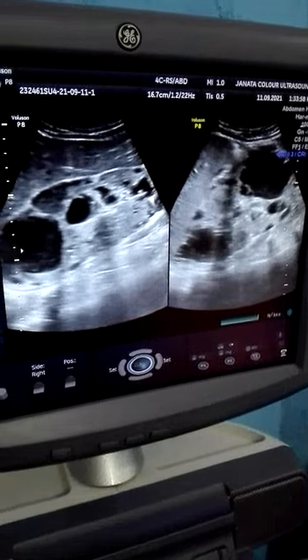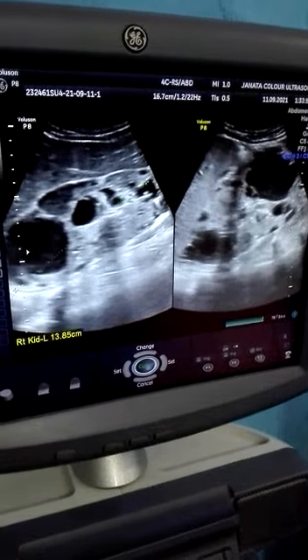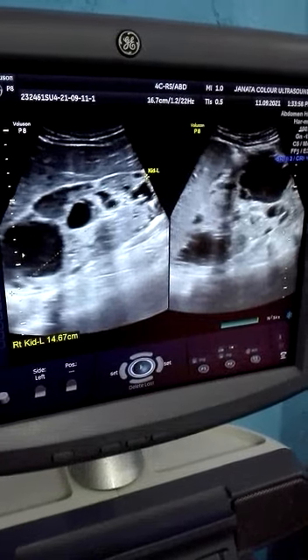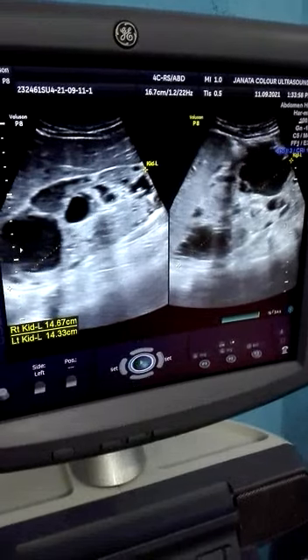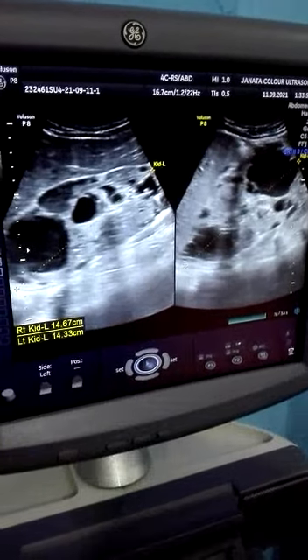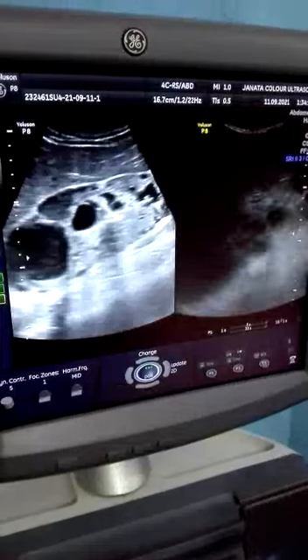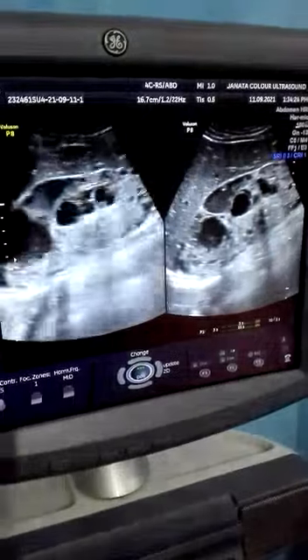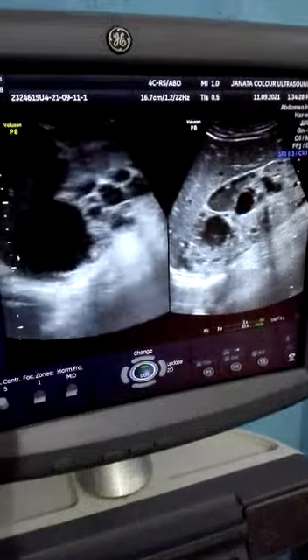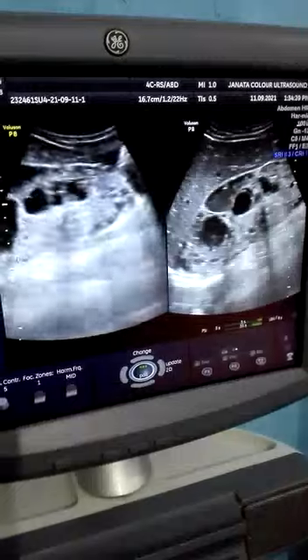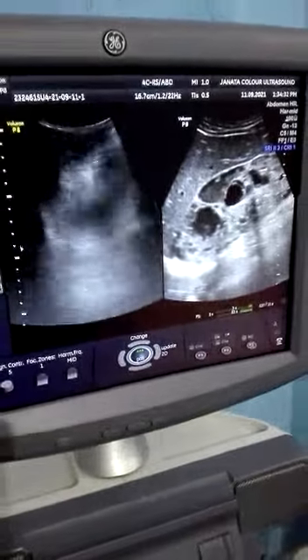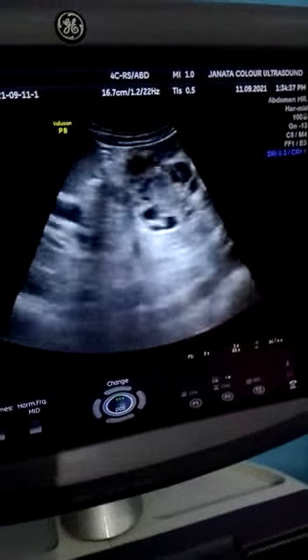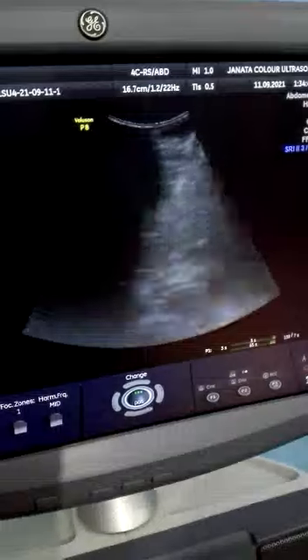Right kidney measures more than 12 cm and left kidney also measures more than 12 cm. Multiple cysts of variable sizes appear originating from both kidneys.